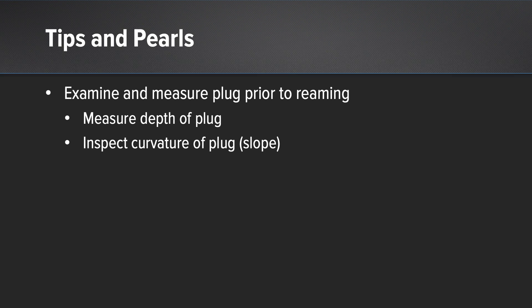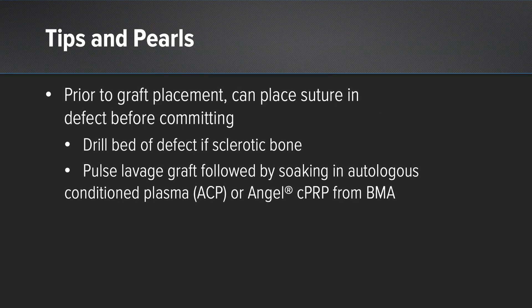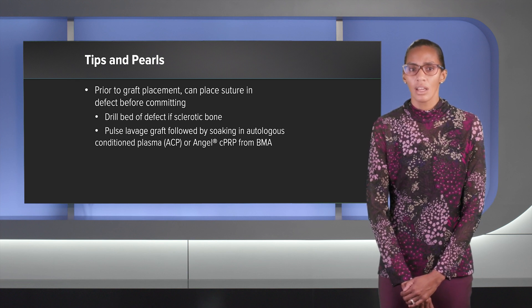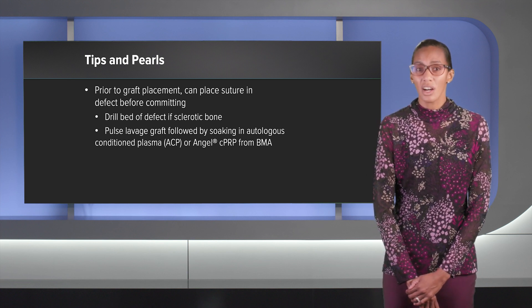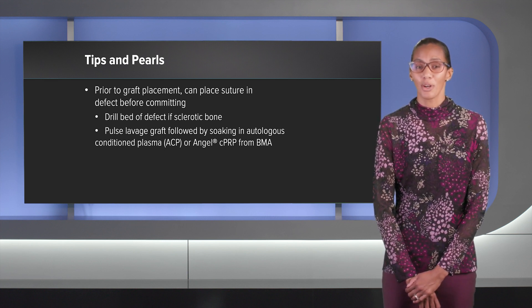Tips and pearls for using these pre-cut core allografts: really want to reiterate that you examine, inspect, and measure that graft before you start reaming. The goal is to place the graft flush, so sometimes I'll ream just a touch more, about 0.5 millimeters on depth. For graft placement, if you don't want to commit, put a number two fiber wire suture in the defect and tamp the graft in lightly — if you don't like how it's going in, the suture lets you pull it out. I usually drill the bed of the defect if there's sclerotic bone to help healing, and really want to pulse lavage the backside of the graft. I usually soak it in ACP, but there is the option of using Angel PRP as well.